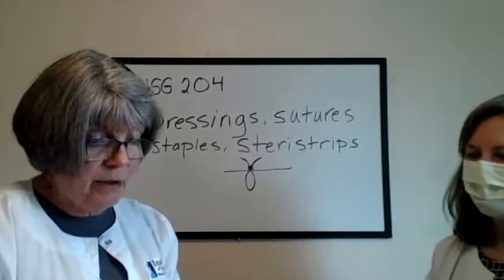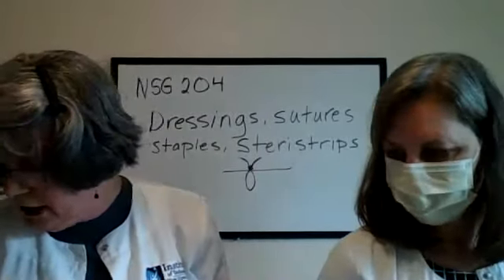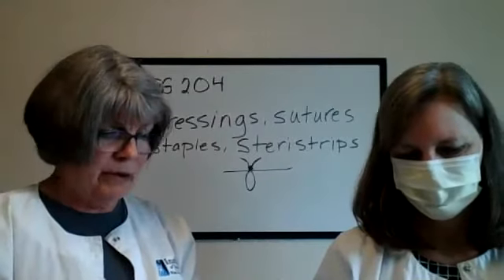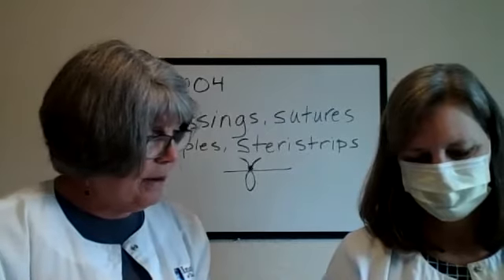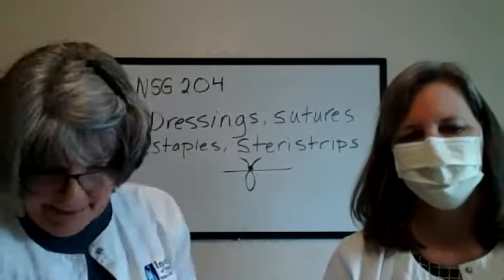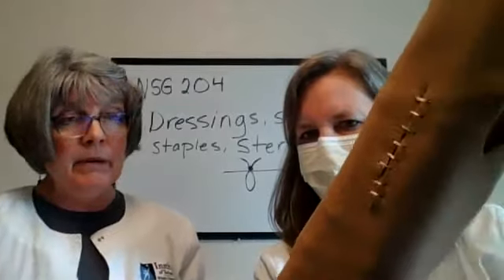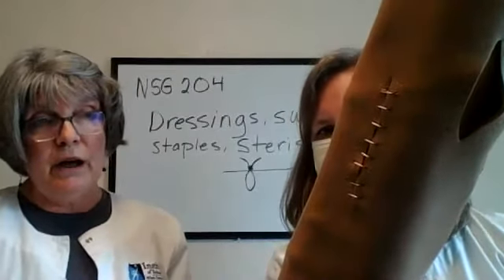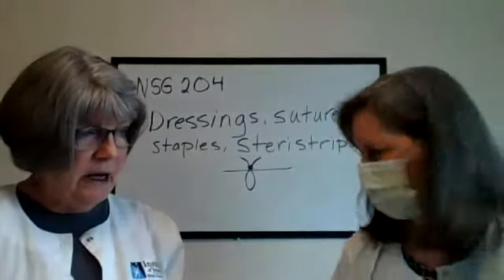Then oftentimes with removing the sutures, what you want to follow up with, you want to do this with both staples and sutures. I wasn't certain whether to talk about this now or go ahead and talk about the staples. Yeah. Let's do the staples so that we have something to show. Absolutely. So with staples, pretty cool. You'll see staples in any sort of surgical procedures that are done, like hip replacements, knee replacements.